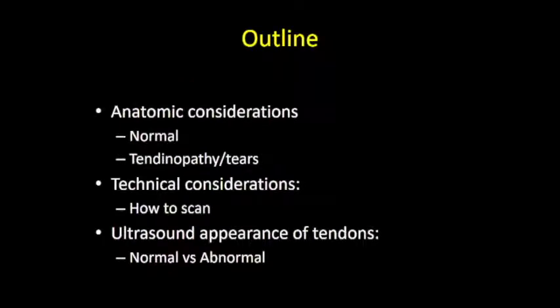I wanted to start out with a few anatomic considerations, since it's good to know the anatomy and how to scan tendons and look at what normal and abnormal look like.